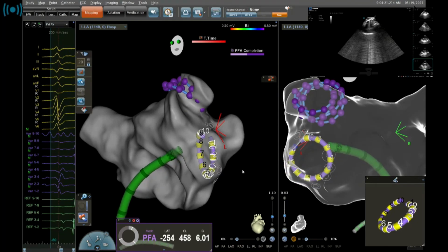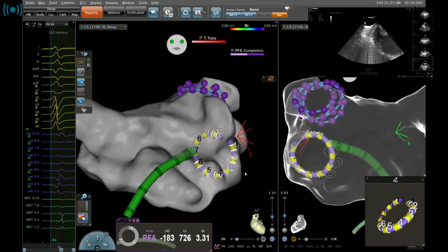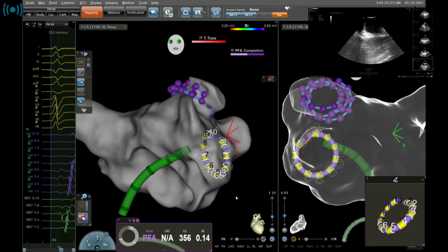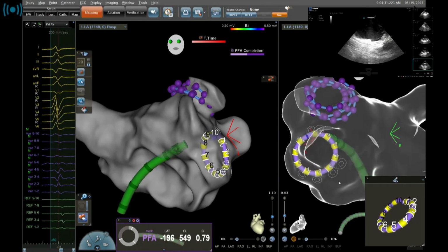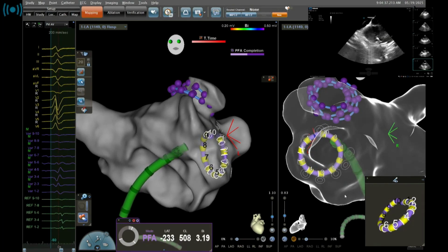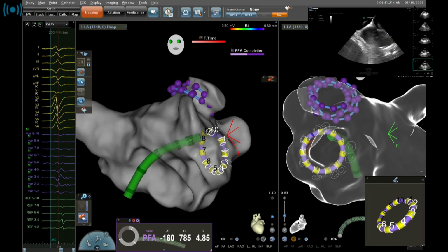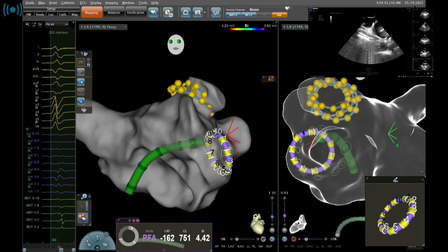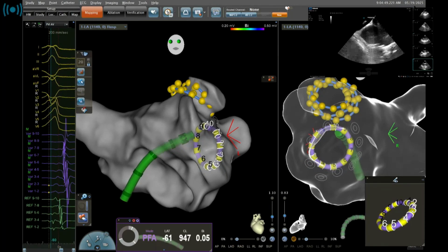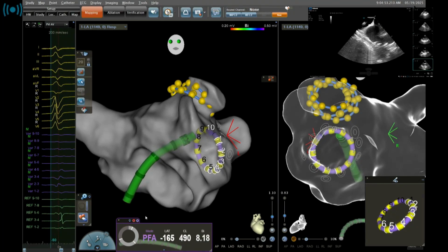So it's electrolysis? Well, it could also be heating. Well, it could be electrolysis. So there's still discussion about that. Yes, for sure, Joseph, for sure. We are studying this topic a lot. I think this is very important also for all new technology arriving. We should pay attention to heating a little bit and also to platelet activation. We are studying platelet activation with a blood specialist, of course.